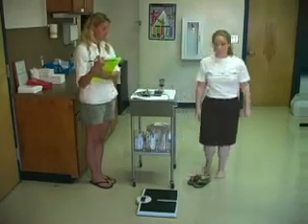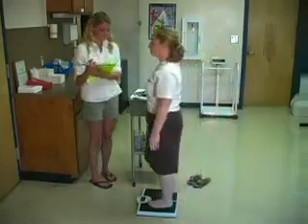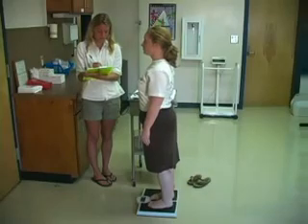Ask the student to step on the scale with both feet and with hands at their sides. Remain still until the weight is recorded.